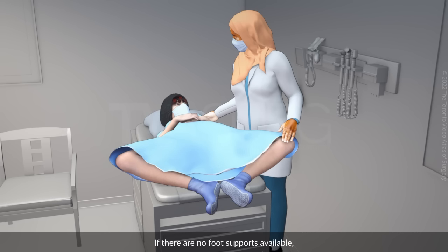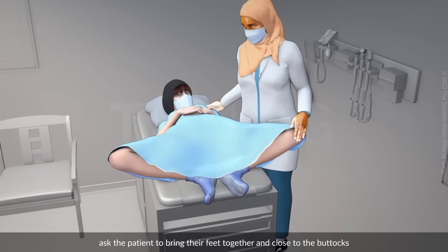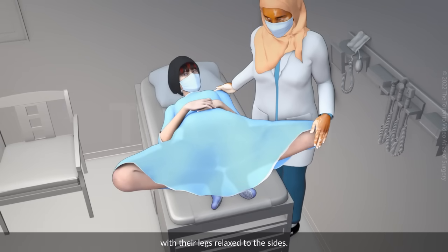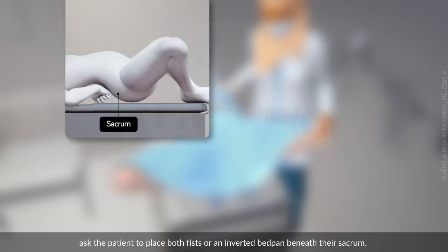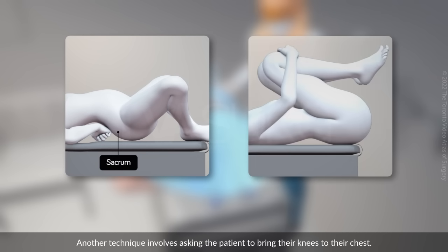If there are no foot supports available, ask the patient to bring their feet together and close to the buttocks, with the legs relaxed to the sides. This is called modified lithotomy, butterfly or frog leg position. If the cervix is difficult to visualise in the modified lithotomy position, ask the patient to place both fists or an inverted bedpan beneath their sacrum. Another technique involves asking the patient to bring their knees to their chest.